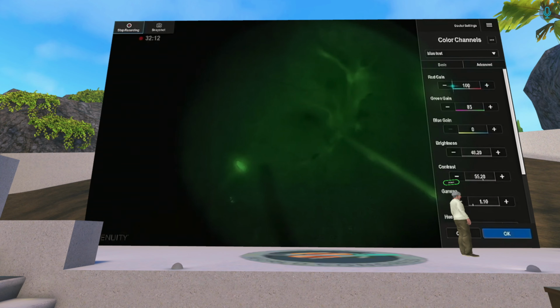Alan, do you use straight light for all your intraoperative cases? Yes, I'm spoiled. I'm in a hospital setting, so I use a chandelier light source on most of my diabetics, and then I have a straight light. It's not a wide field light, it's a straight light.